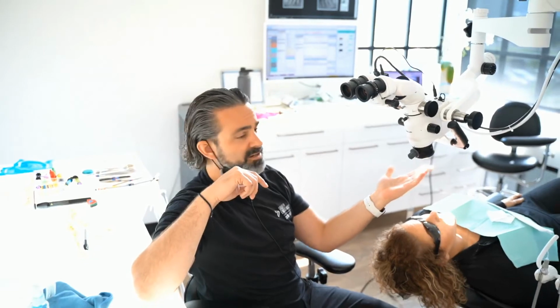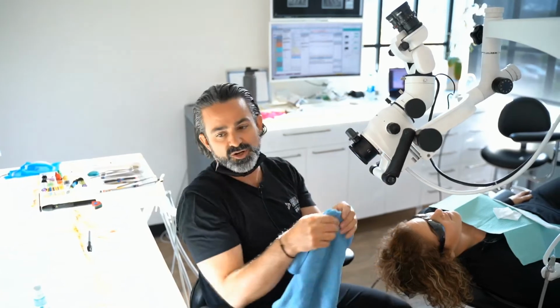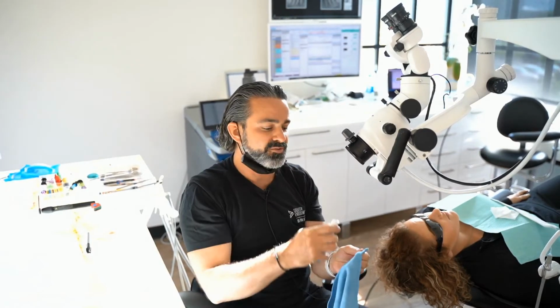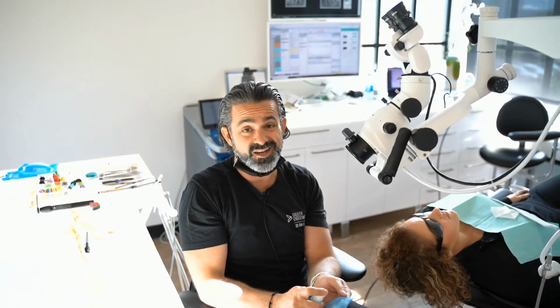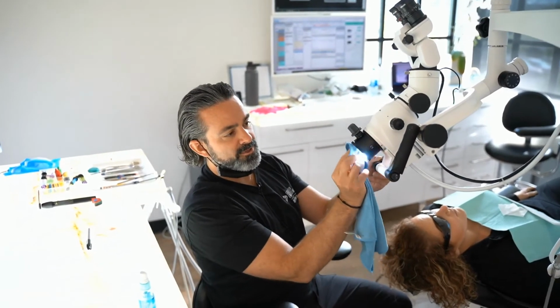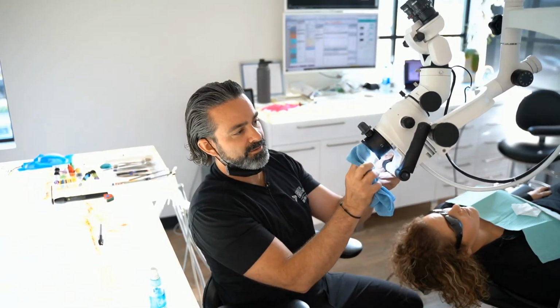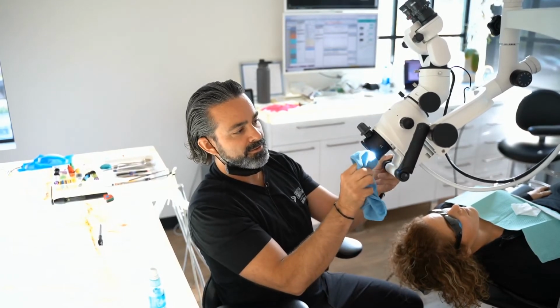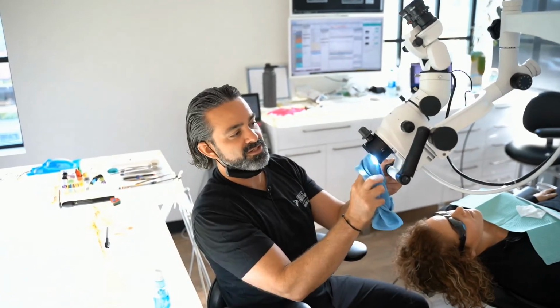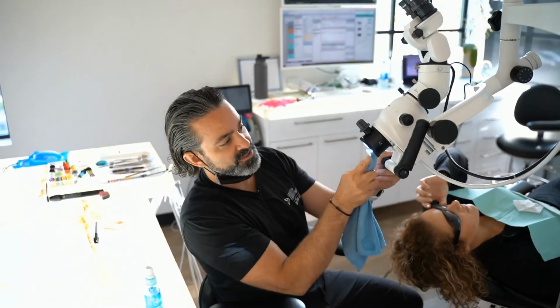Underneath, under the lens here, that's important because your assistants are always spraying water. You can put a bag filter over it, but at higher magnification you can kind of see the bag or the cap. They make disposable devices, but you can take this and clean it like so. My staff will do this in between every patient regardless, because you get to be kind of a lens snob, which is why I cut my eyelashes.